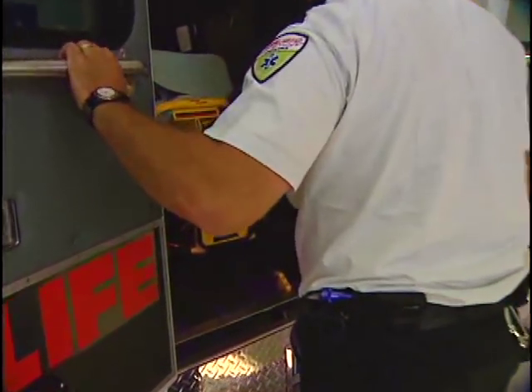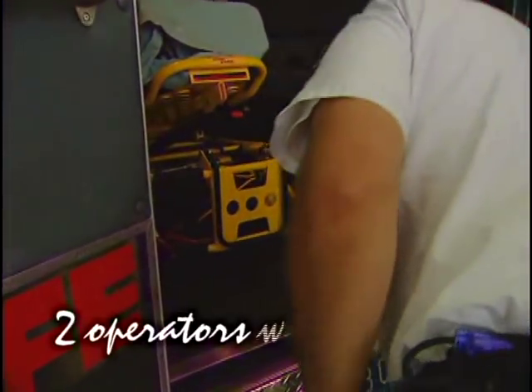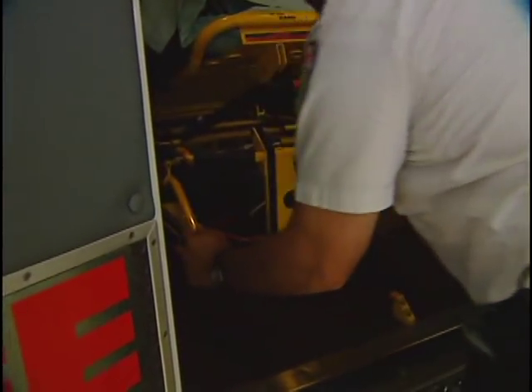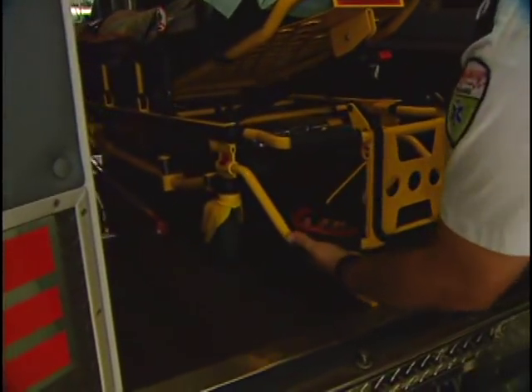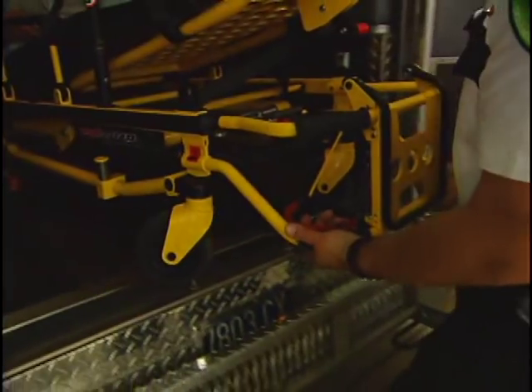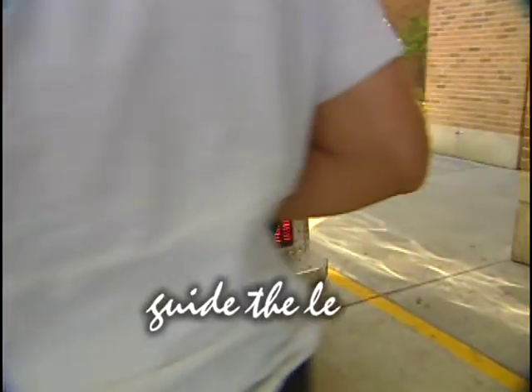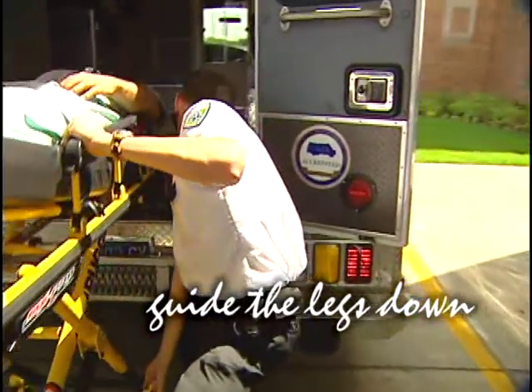To unload the cot with a patient, good safety practices call for two operators. Release the cot from the fastener and guide the cot out using the lower grips to help reduce back strain. When the safety hook engages the safety bar, the second operator guides the legs down to make sure that they're fully extended and locked.